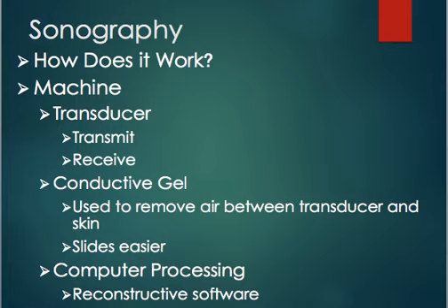So those sound waves will travel out of the transducer, and then it receives the echo as they bounce back off of the organs. So the transducer acts as a transmitter and a receiver. It's transmitting those sound waves out, they go through the body, they bounce off the organs, and then they come back, and the transducer receives those echoes again.